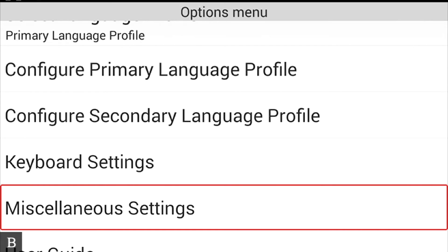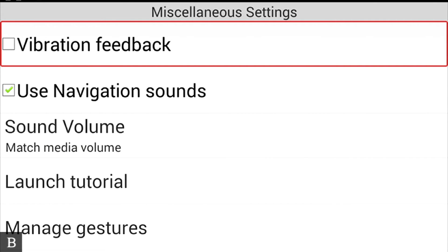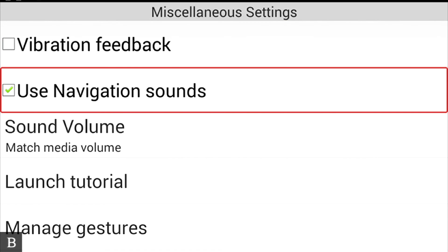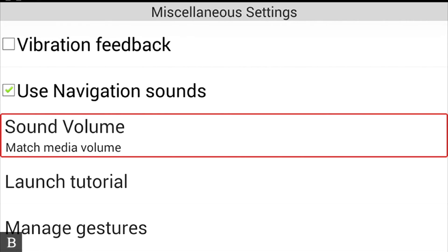Pressing next takes us to Miscellaneous Settings. Vibration Feedback is not checked — this is specifically for vibration when navigating among menu items or pressing thumb keys. I prefer not to have it on as it vibrates a bit too much. Use Navigation Sounds is checked — these are what people often call earcons, the clicks and sounds with screen changes. I like to keep them on. Sound Volume is set to Match Media Volume, so earcons match the media volume level.